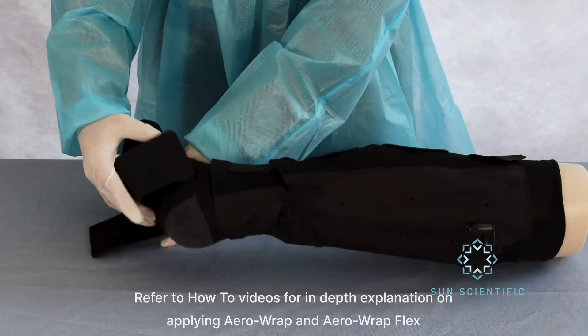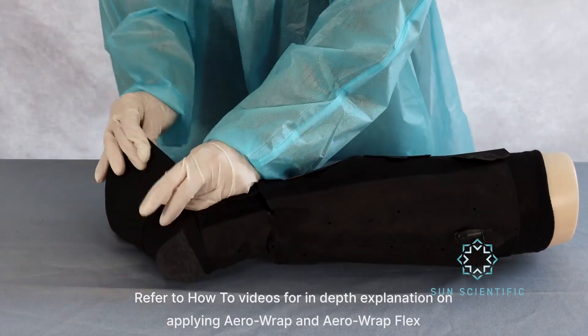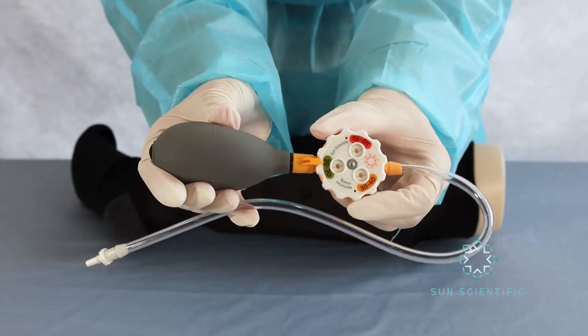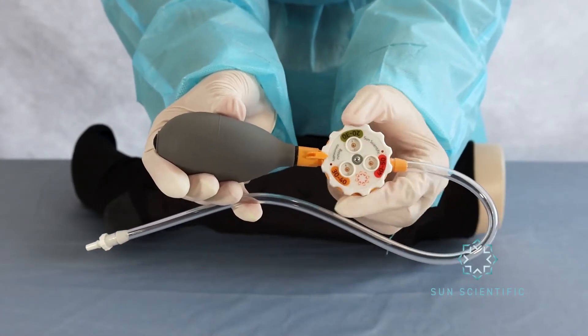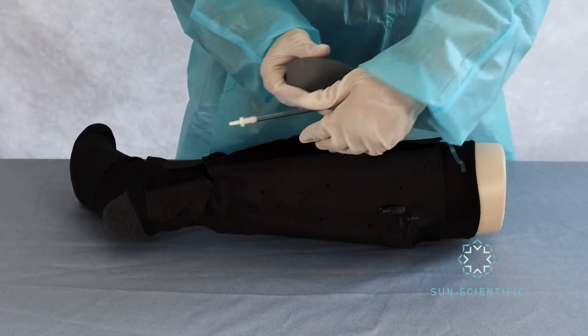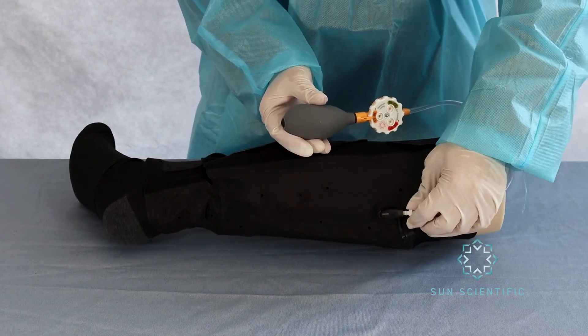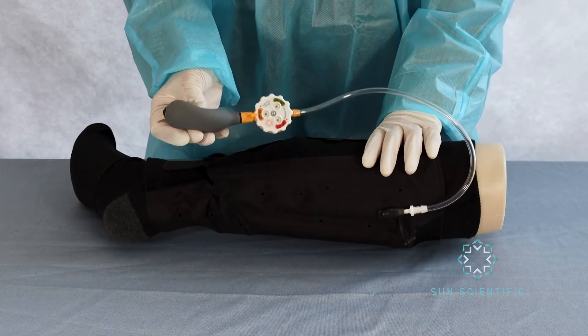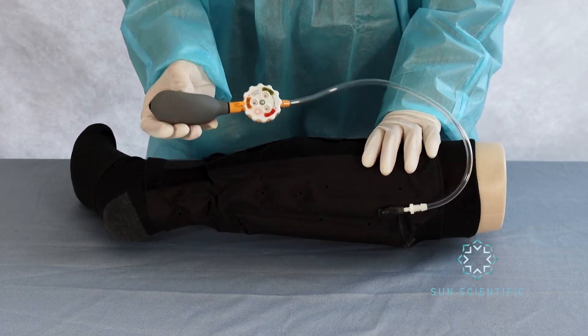Then attach the elastic foot strap if it is being used. Pick up the AeroGauge, which has three levels of compression — use whatever is prescribed or suits best for that particular case. It will click when rotated to the pressure range. Insert the tube into the valve on the sleeve after removing the dust cap and squeeze 7 to 10 times. Plug the dust cap when completed.